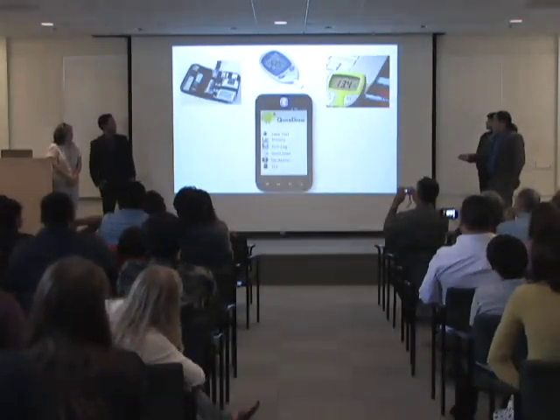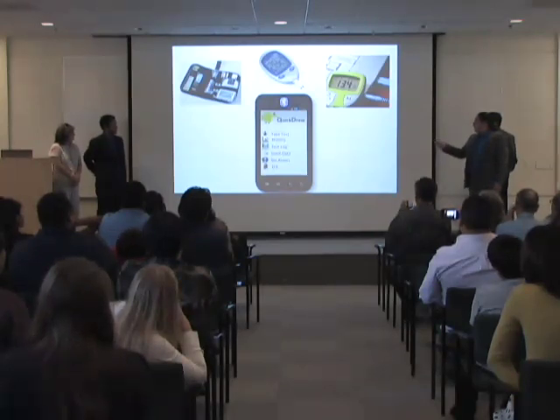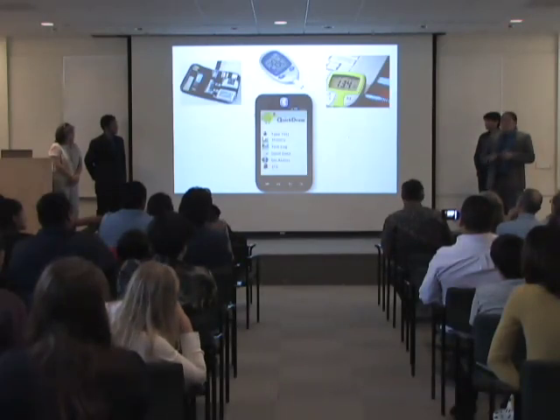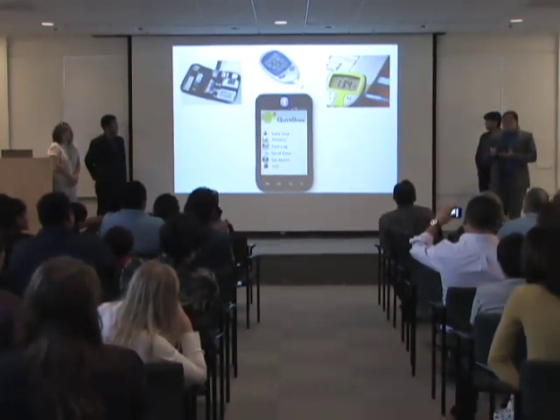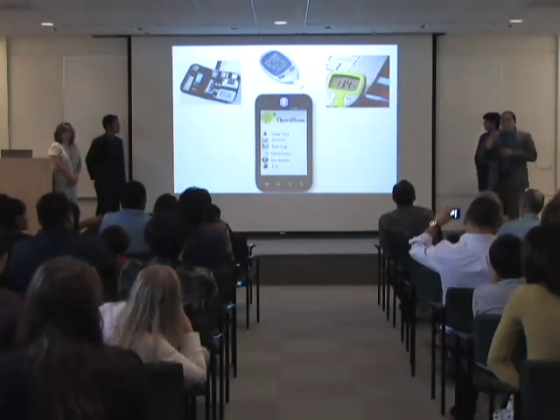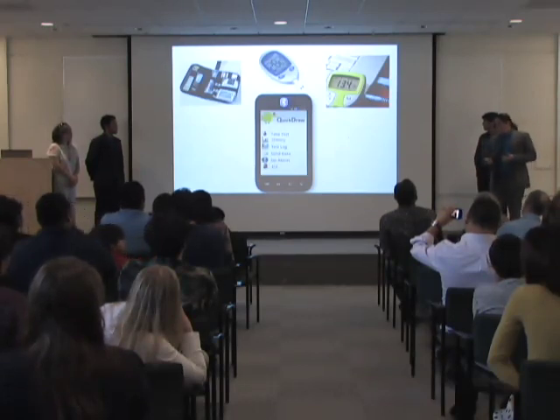Well, here we have some monitors that we see. Most of us are familiar with them. The first one is fairly old. It's operated on two AA batteries, which makes the device really bulky. And one of the things is that you have to log in your glucose readings, which is kind of inconvenient. You have to carry a lot of stuff. The next one is a bit smaller, but still operates on a watch battery. And since it has limited data storage, you still have to write down your glucose readings.